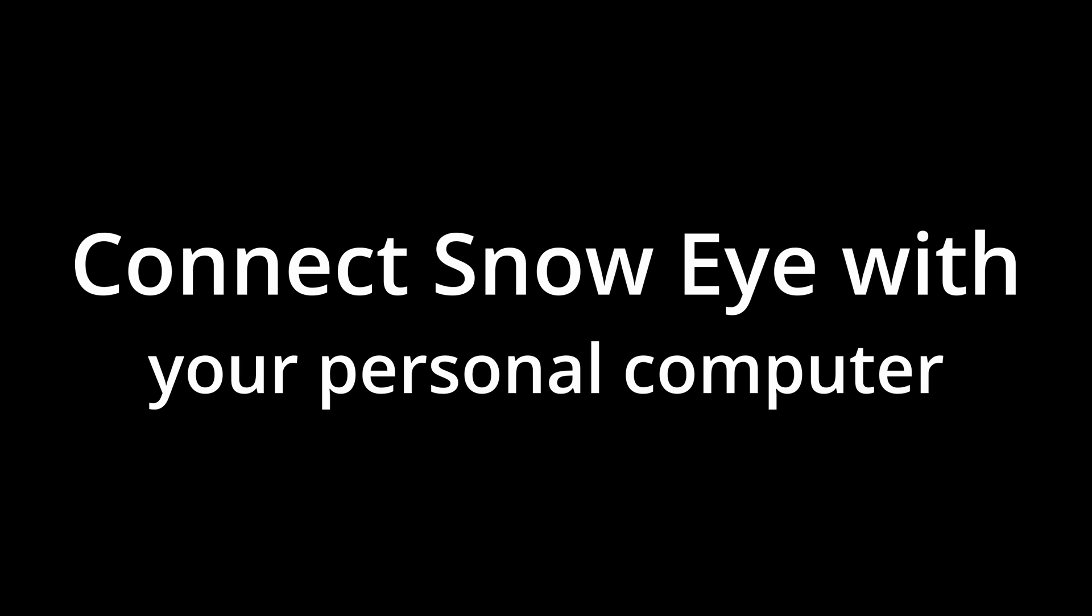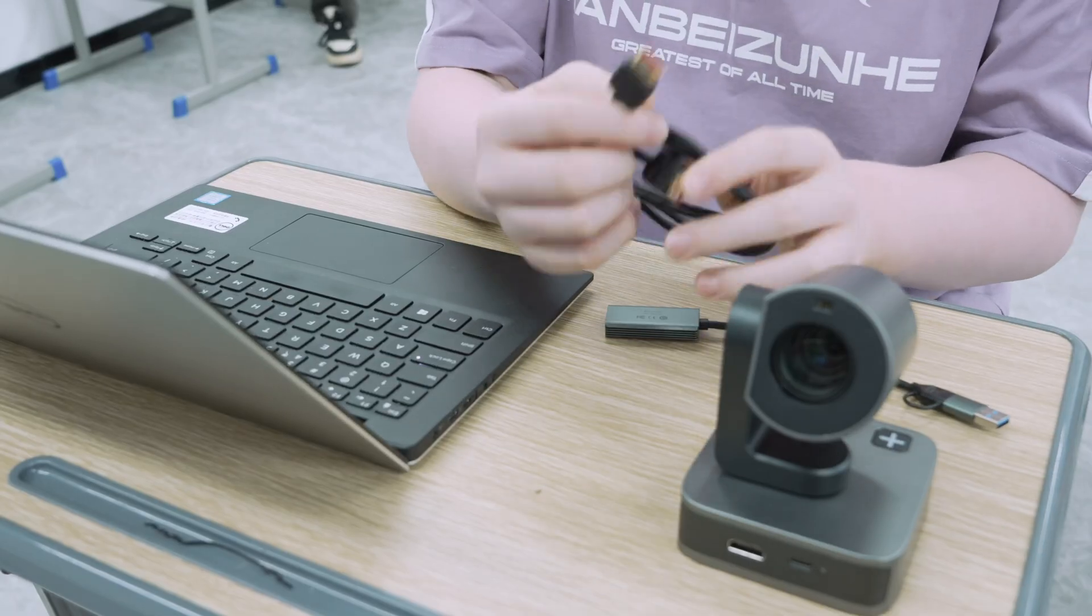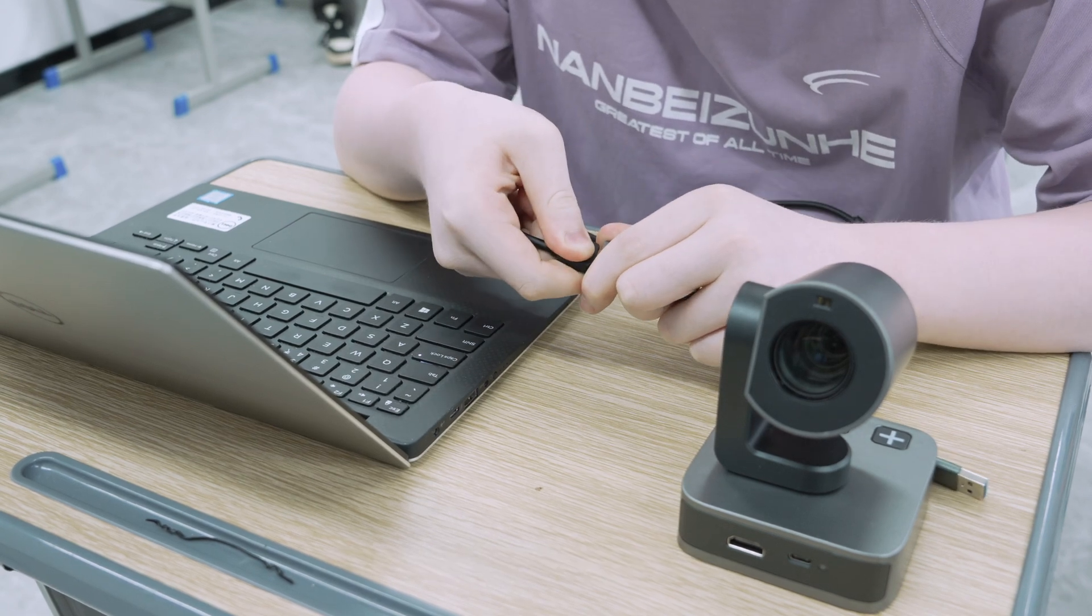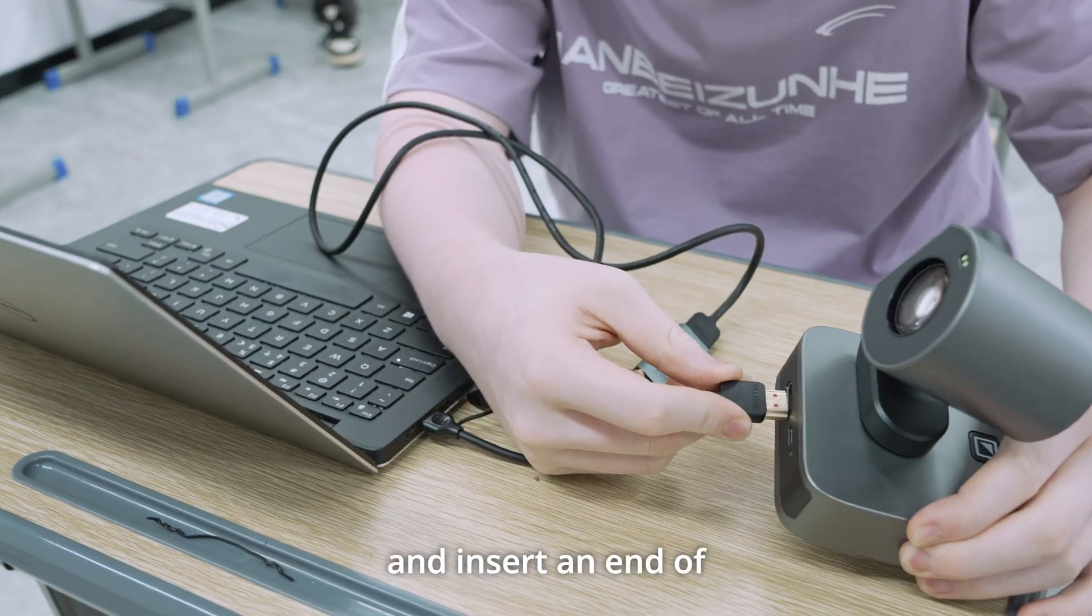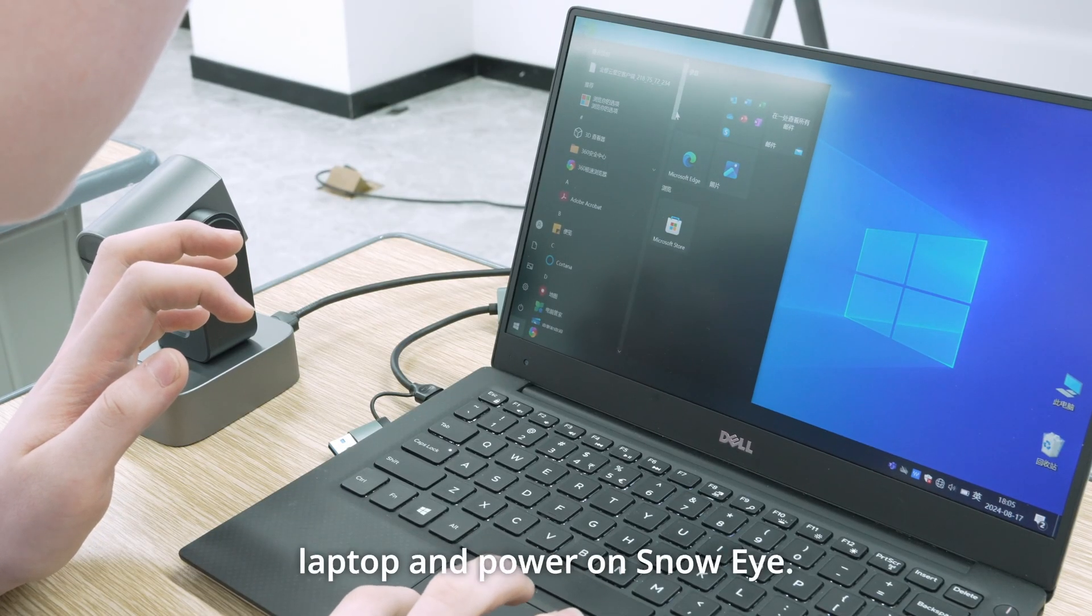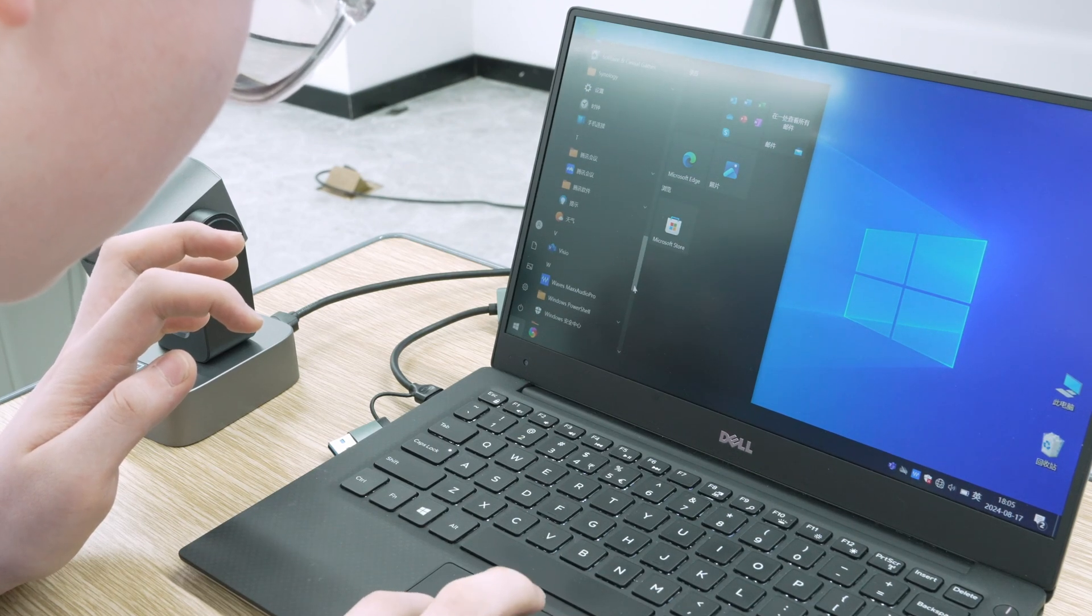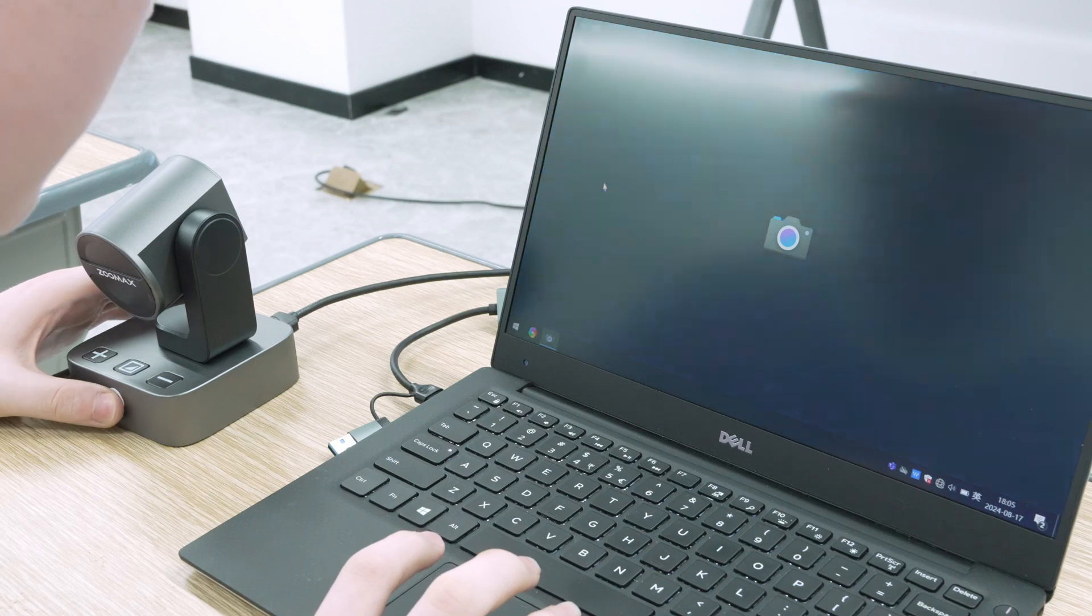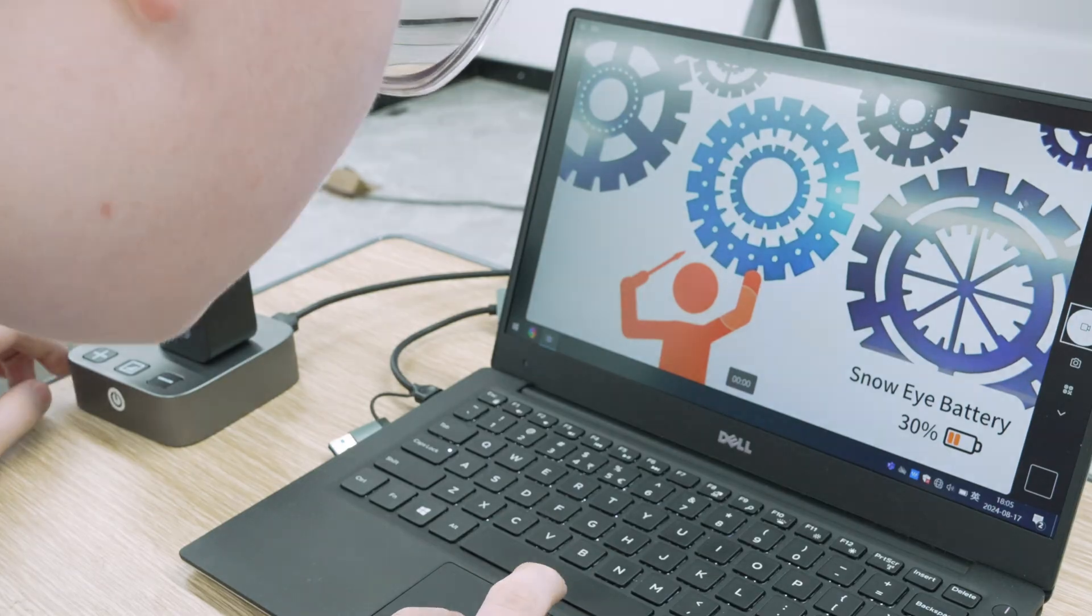Connect Snow Eye with your personal computer. You can connect Snow Eye with your laptop if you need distance viewing. Connect the HDMI cable and the video capture card. Insert the video capture card into the port in your laptop, and insert an end of HDMI cable into Snow Eye. Find the camera on your laptop and power on Snow Eye. Wait for seconds till it shows the distance viewing live image on your screen.